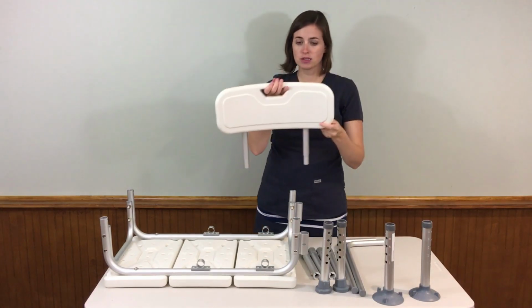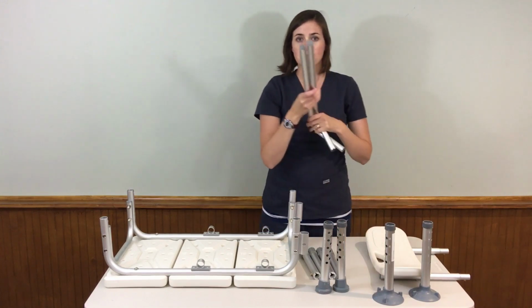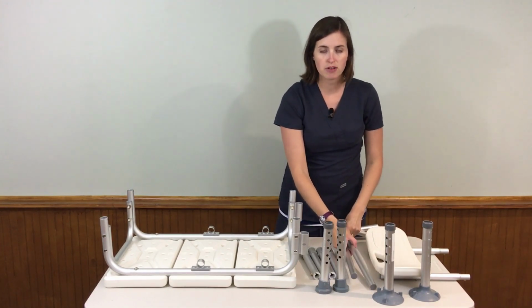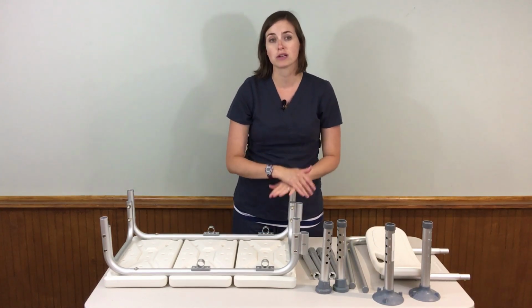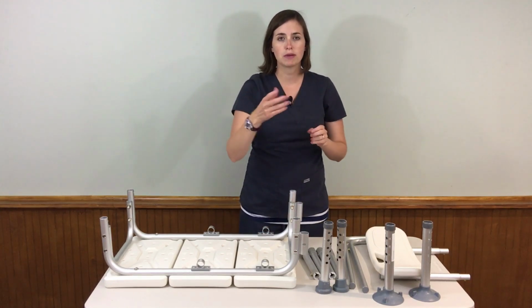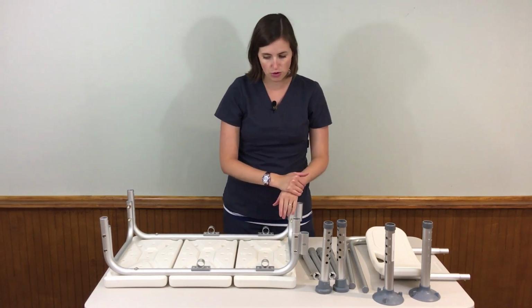You're going to have a backrest, and then you're going to have your backrest mount. In addition, this one doesn't have it in this particular model, but in some of them you'll also have an armrest piece, which is a U-shaped piece that's kind of slightly bent outward. So that's the armrest if you have that with your supplies.